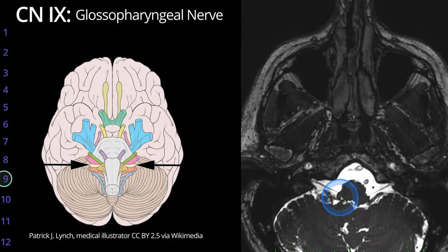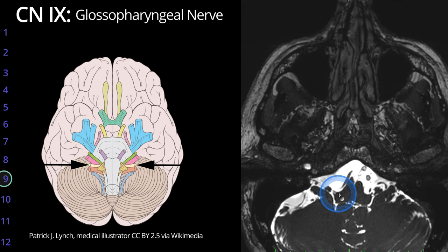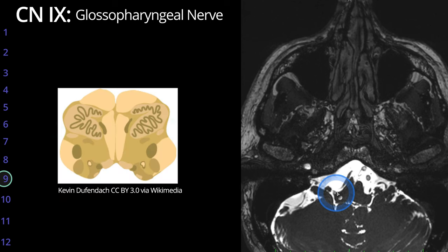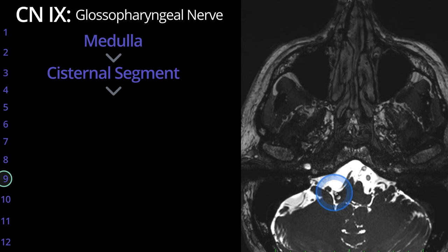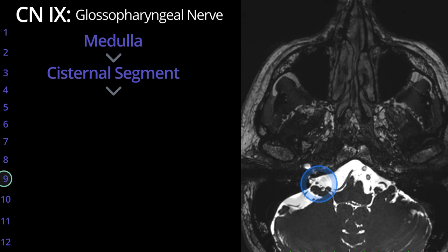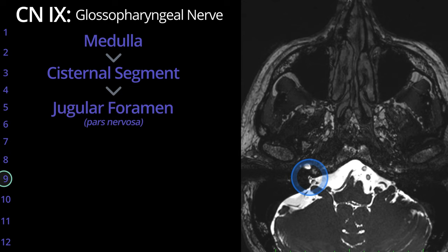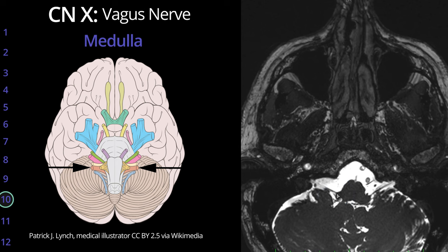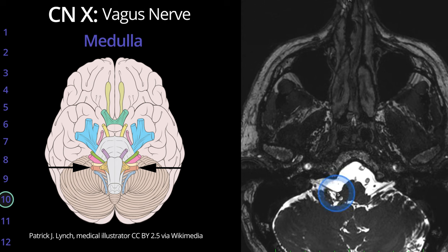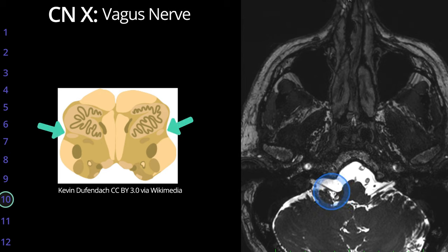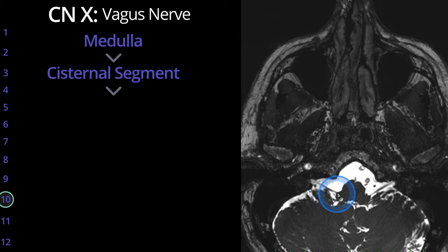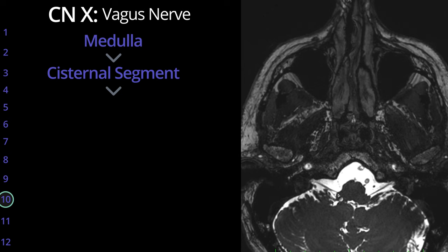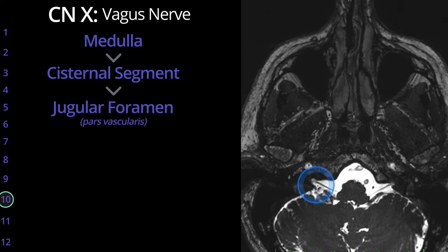Cranial nerve 9, the glossopharyngeal nerve, exits the medulla in the postolivary sulcus, extending laterally to exit the skull base through the pars nervosa of the jugular foramen. The vagus nerve, cranial nerve 10, exits the medulla at the same level of the postolivary sulcus, extending laterally immediately inferior to the glossopharyngeal nerve, with the vagus nerve exiting through the pars vascularis of the jugular foramen.